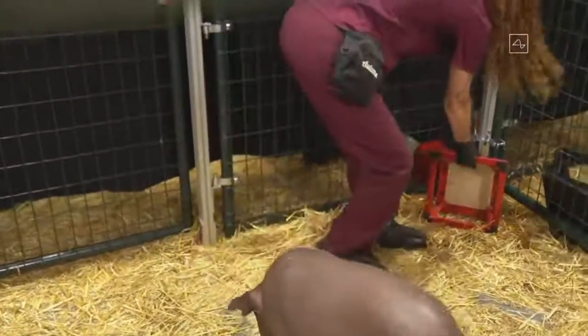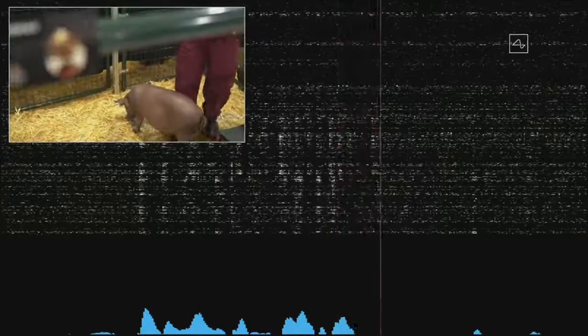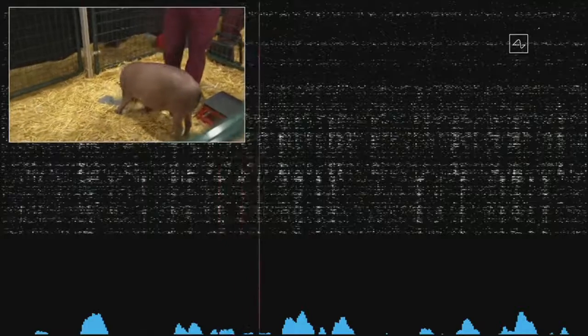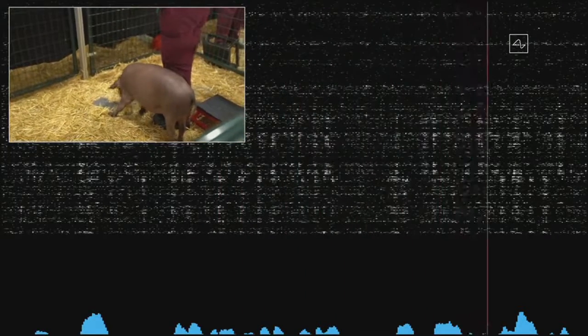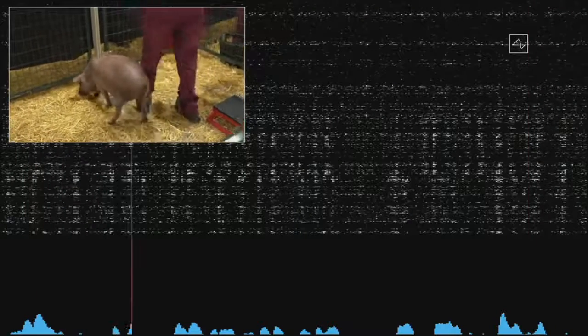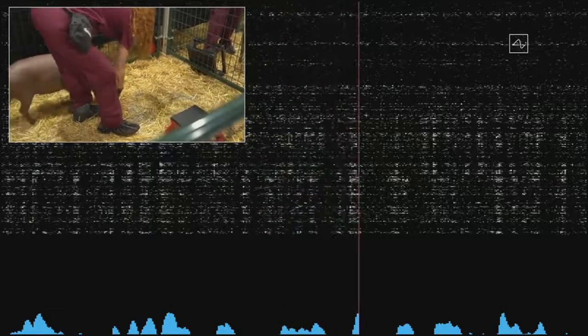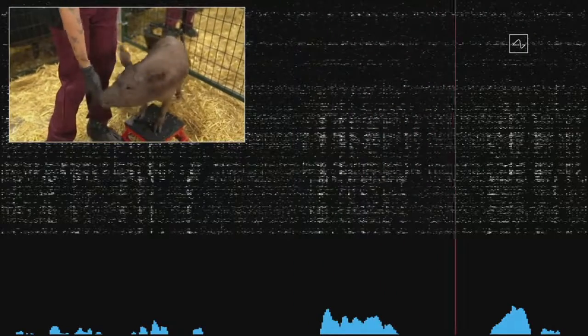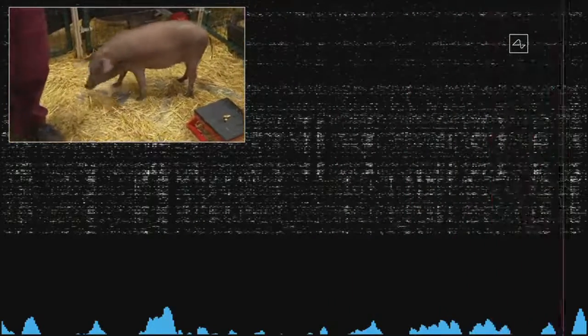OK, this is a high-energy pig. All right, Gertrude, thanks for coming out. The beeps you're hearing are real-time signals from the Neuralink in Gertrude's head. This Neuralink connects to neurons that are in her snout. Whenever she snuffles around and touches something with her snout, that sends out neural spikes, which are detected here. On the screen, you can see each of the spikes from the 1,024 electrodes. If she touches her snout to the ground, or you feed her some food, pigs love food, you can see the neurons fire much more than when you're not touching the snout. And that's what's making the beeping sound.